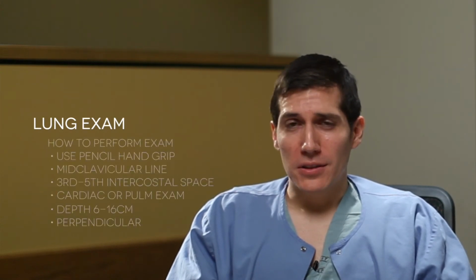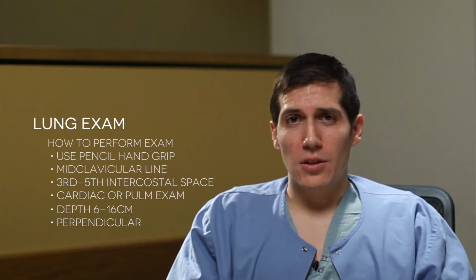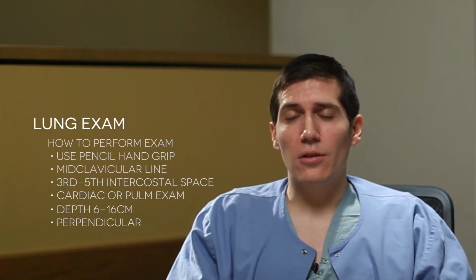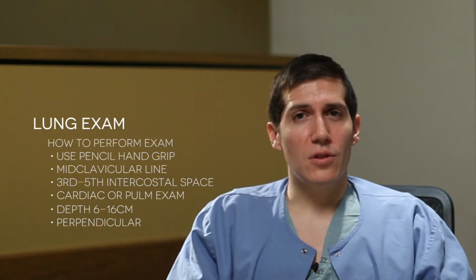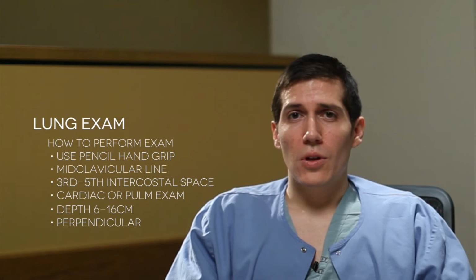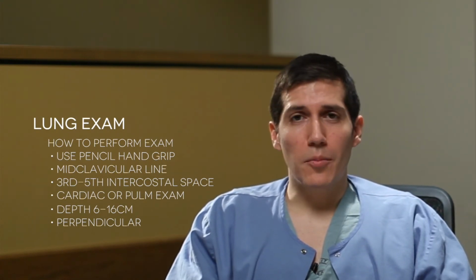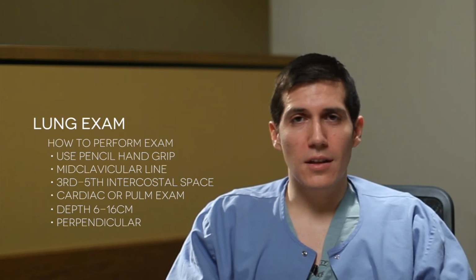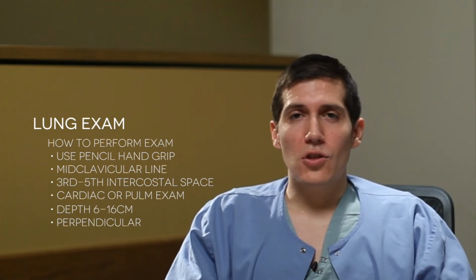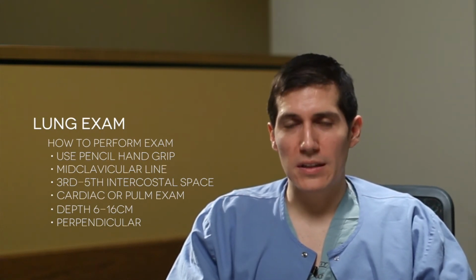Other tips for you. Remember how to do this exam. You're going to grip the probe with a pencil grip. You're going to start to place it in the midclavicular line, 3rd to 5th space for the supine patient, because air rises. And you're going to select either a cardiac or a pulmonary exam on the ultrasound. Your depth can be anywhere between 6 to 16 centimeters. The angulation is going to be perpendicular to the chest wall, and there's no need for rotation or tilt for this exam. There are pitfalls to this technique.